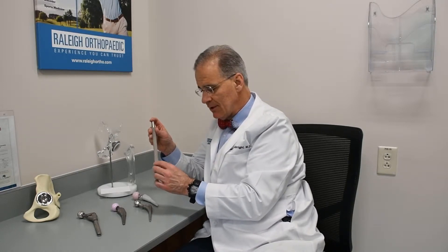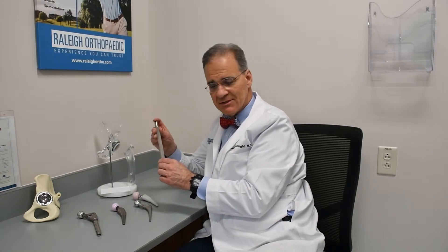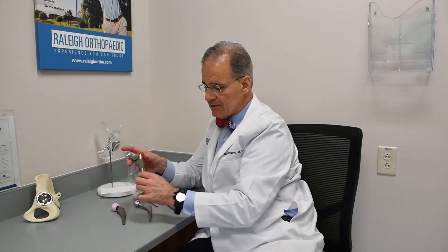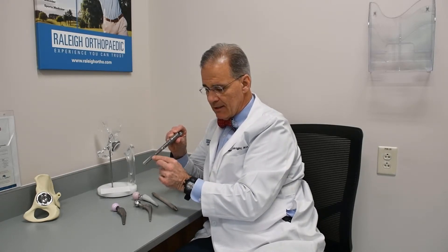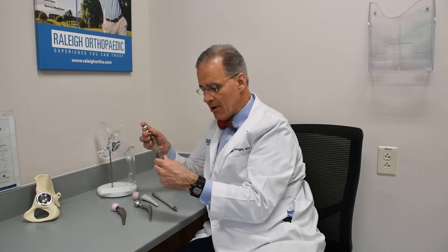Over six weeks, your bone literally interlocks, biologically interlocks with the metal. Very solid. This is cylindrical. There are also tapered stems, fluted stems which have ridges. This is a famous SROM stem with flutes on it — little creases in there for stress transfer. Different shapes. They're modular; they come apart.